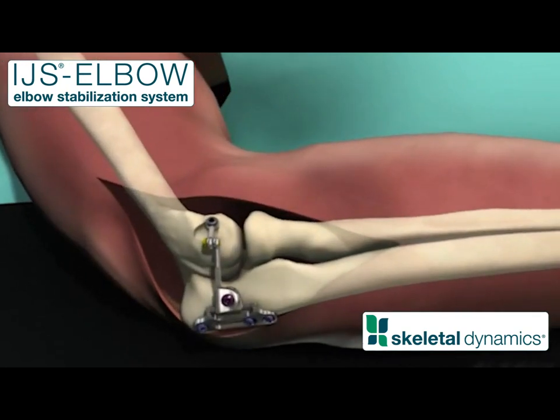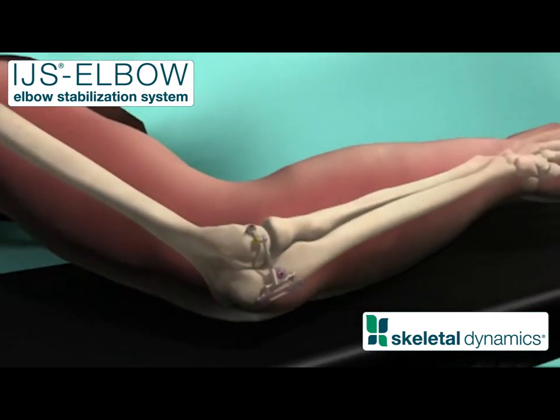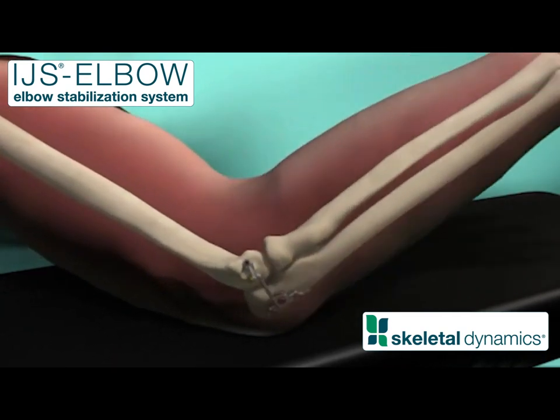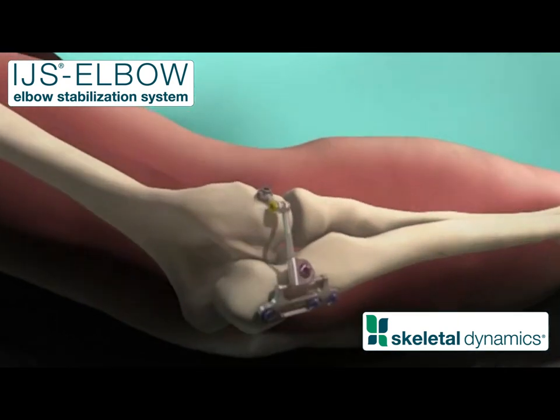Close the incision. The internal joint stabilization implant is supplied as a pre-assembled unit including the ulnar plate, humeral locking joint, and connecting rod. The IJS implant should be removed when tissue healing has provided sufficient joint stability.